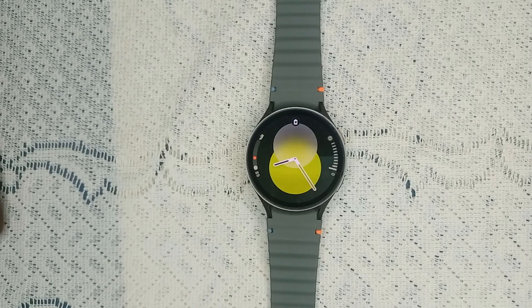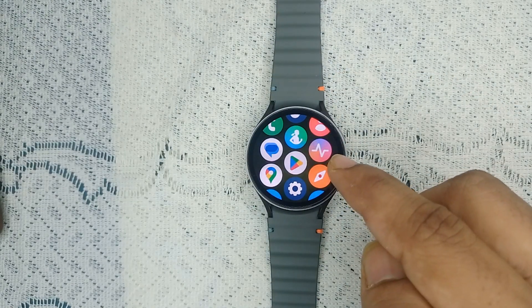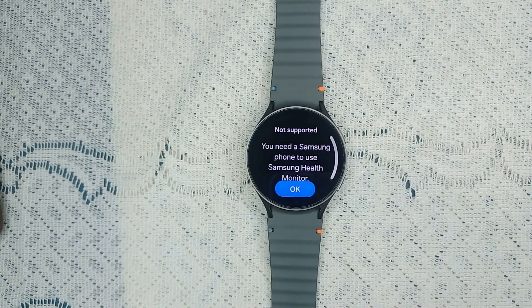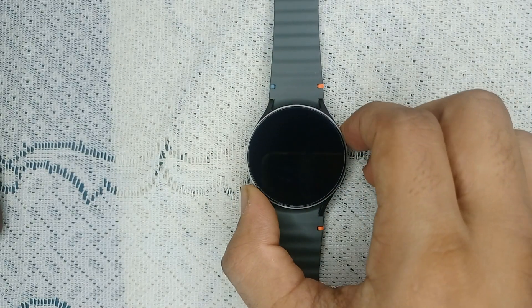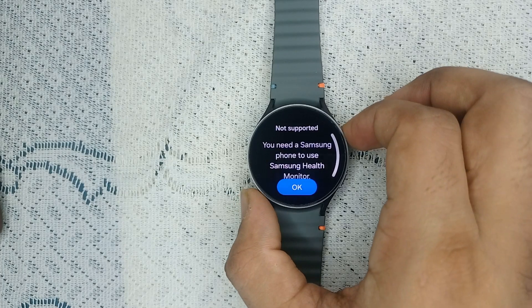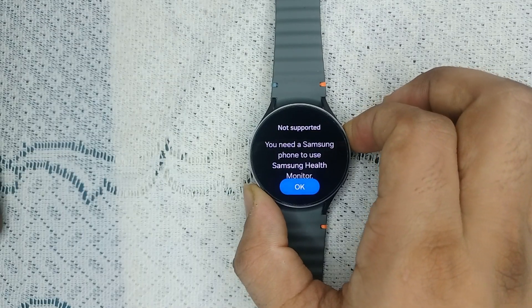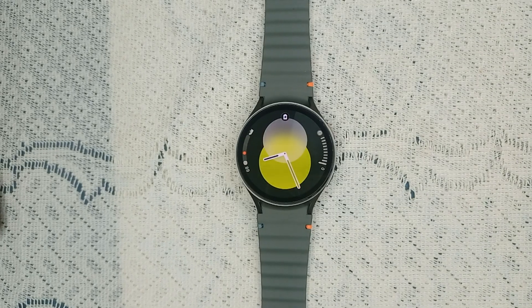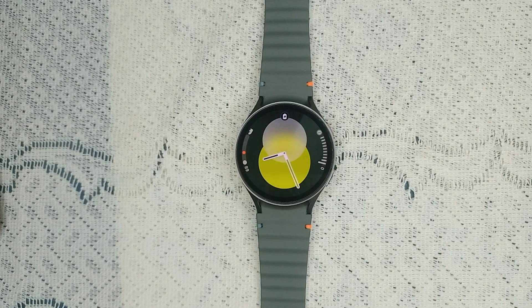Once you download the app, the logo looks like this. After that, when you open the app on your watch, you will see two options: measure your blood pressure and measure your ECG. You can then simply turn on 'measure blood pressure' and tap on it to measure your blood pressure.